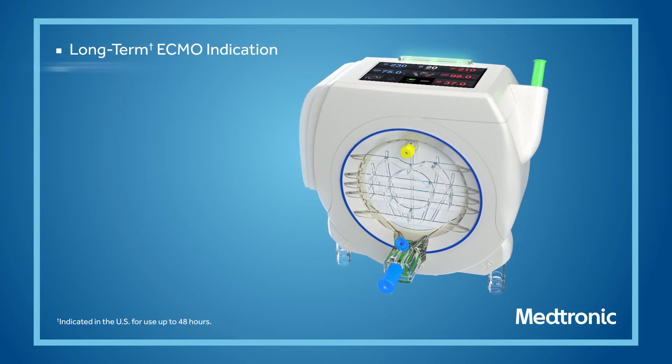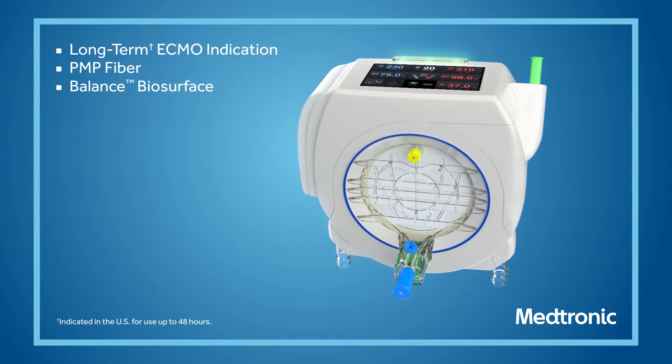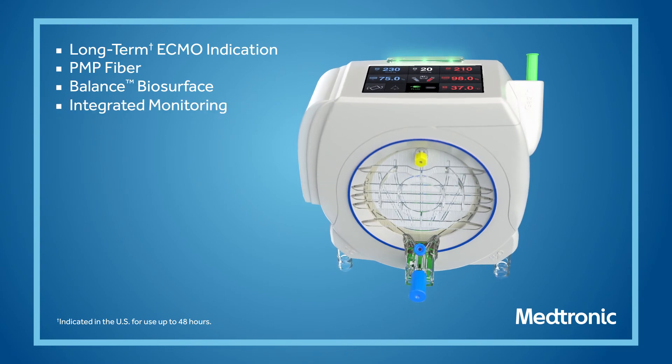Simplify your circuit with the first oxygenator featuring integrated monitoring. Nautilus Smart ECMO module.